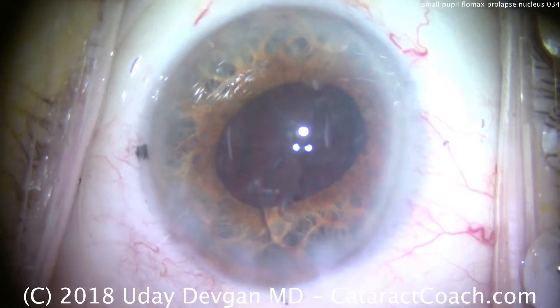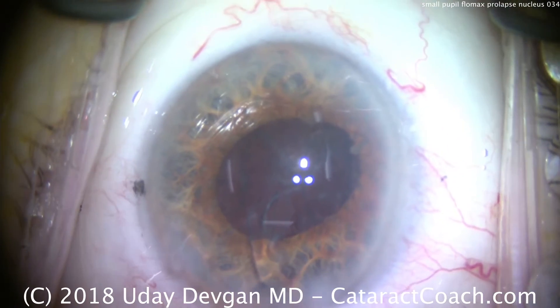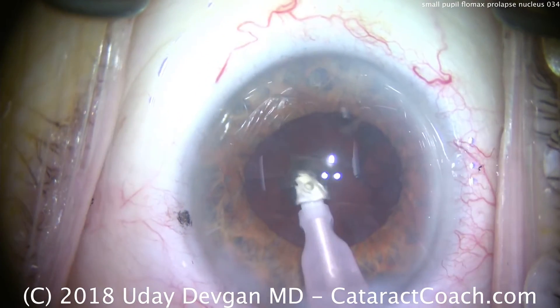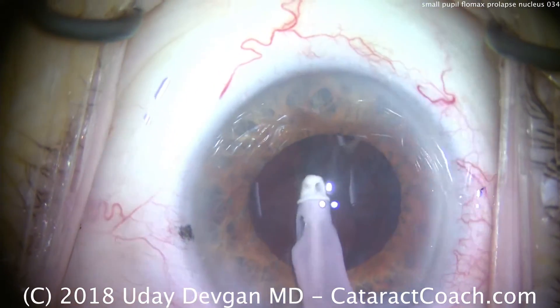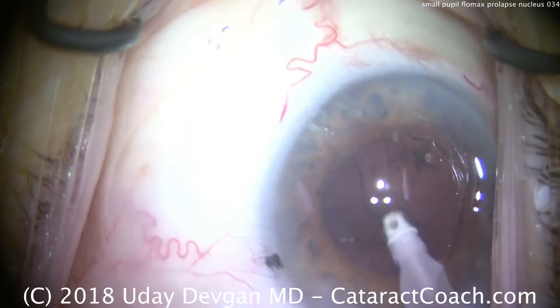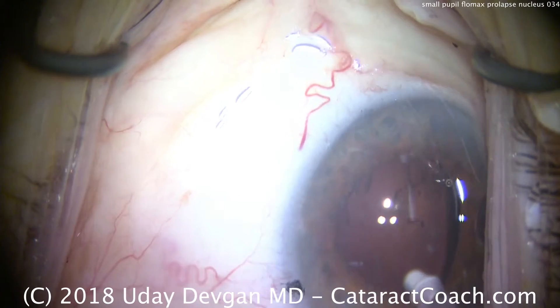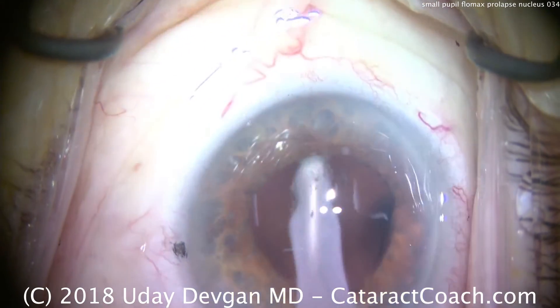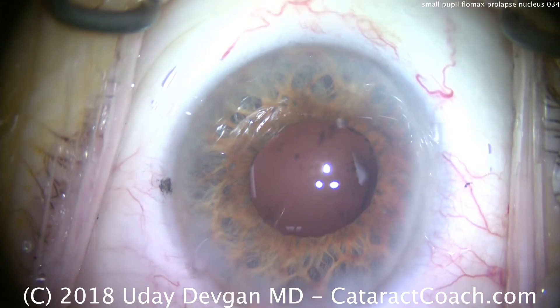Note that the pupil starts to come down again — very typical for this Flomax-type patient. We take the I/A probe, put it in the eye, and take out this little bit of epinuclear shell and the cortex, going 360 degrees. We make sure we get under the rexis edge, which means the tip disappears under the iris, and we want to make sure we remove all the cortex from 360 degrees. In a smaller pupil case like this, you could inadvertently end up leaving some nuclear material or cortex behind — we've got to be careful that we don't.